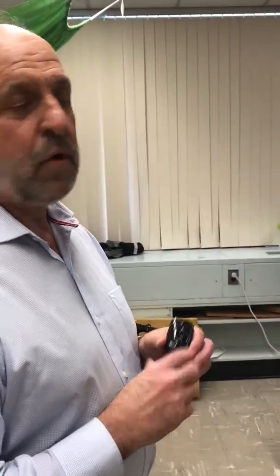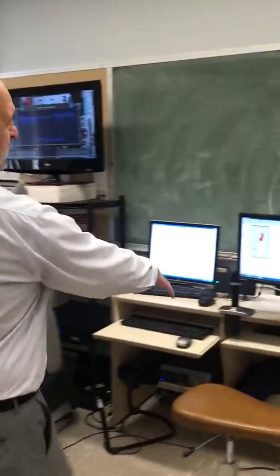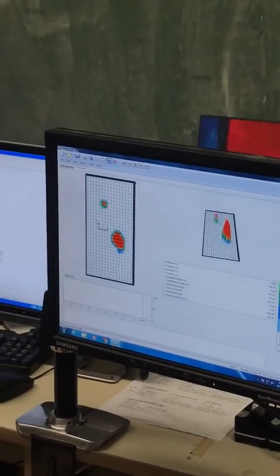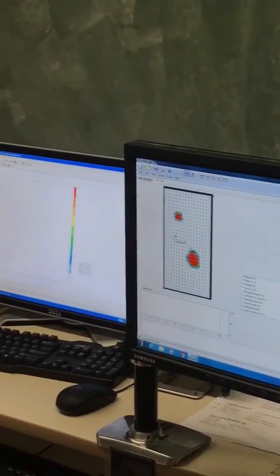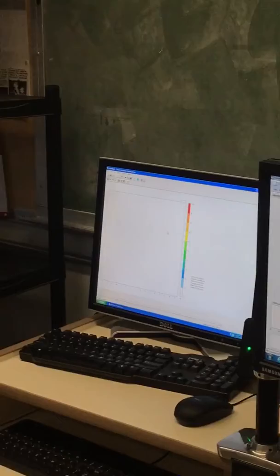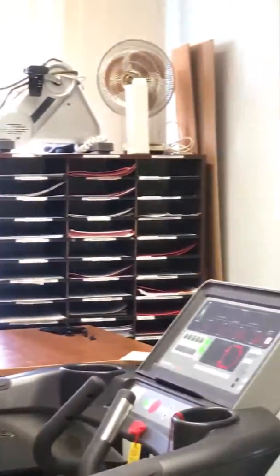Just to wrap this first segment up: Dr. Tony Styurm, how do you use this information on a practical basis? We do two things. We can do a full assessment of their performance. The other thing about this data is we can take the center foot pressure data and parse it, and we've developed a gait stability measure. So we have a motor coordination measure and a gait stability measure, a very complex data analysis. We can tell you their performance level, their gait, their stability, and their dual task performance.